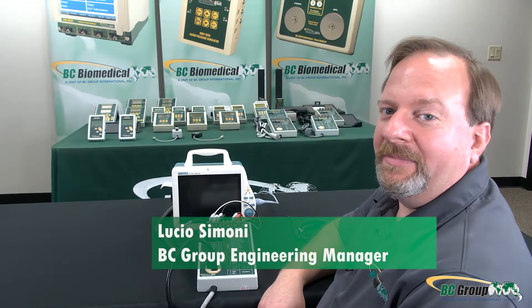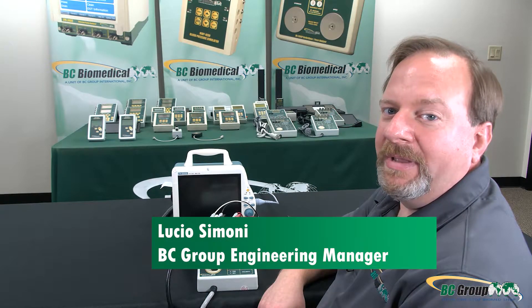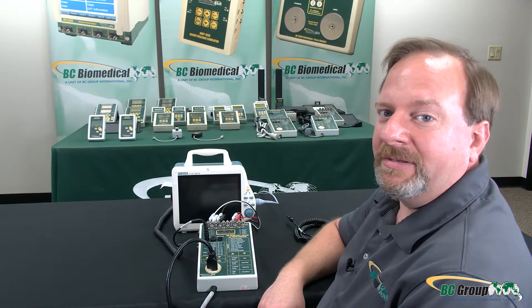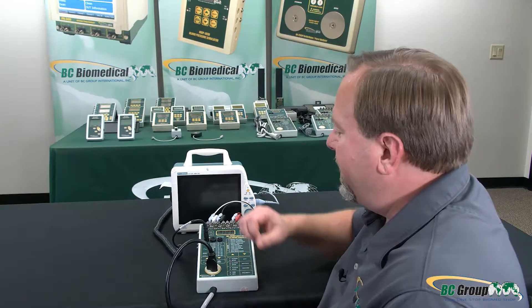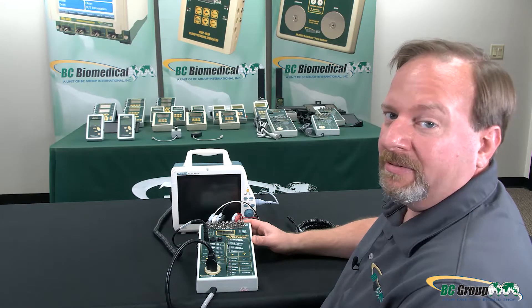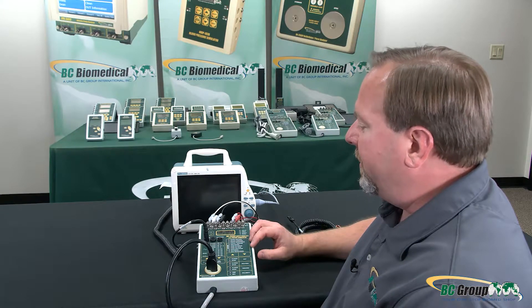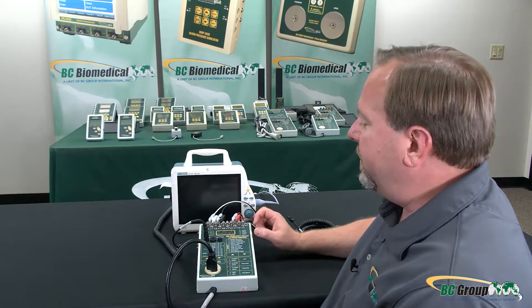Hi, my name is Lucio Simoni. I'm the engineering manager for BC Group, and in this video we'll be demonstrating the features and functions of the SA2000 series safety analyzer. In this case we have the SA2010S model — our fully featured safety analyzer with patient simulator and 10-lead ECG testing.